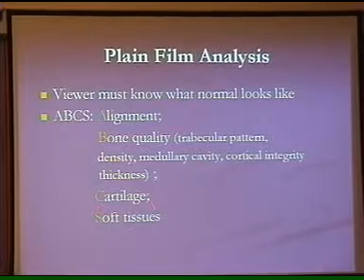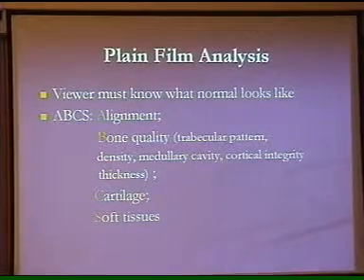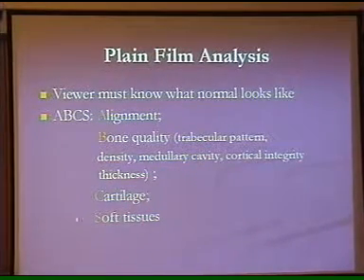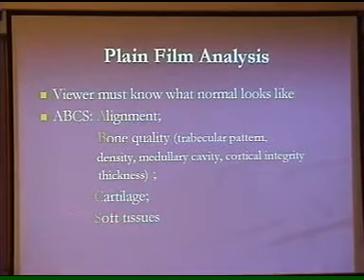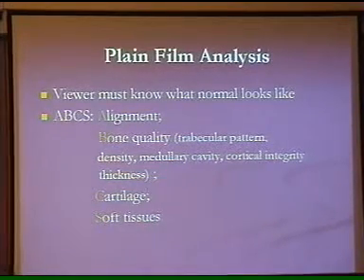The soft tissues, are they normal, or are they showing any calcifications, any bone formation? Because certain tumors grow out and produce new bone formation, like osteosarcoma. I'll show you, you'll find the densities, or in chondrosarcomas, you can appreciate the soft tissue calcifications. So we have to appreciate the soft tissues. Are they normal, are they well preserved planes, or are they disturbed?